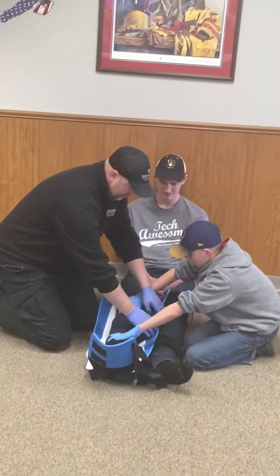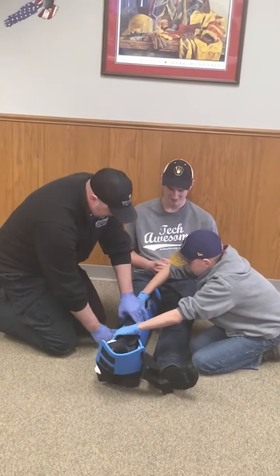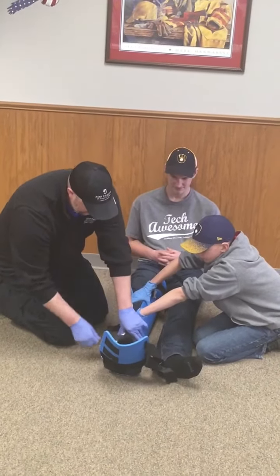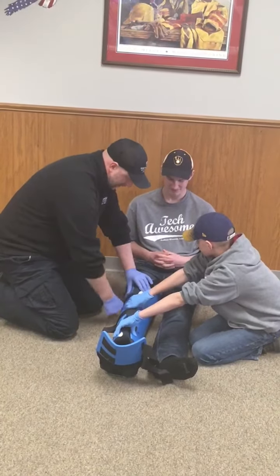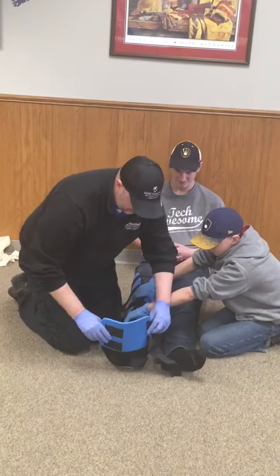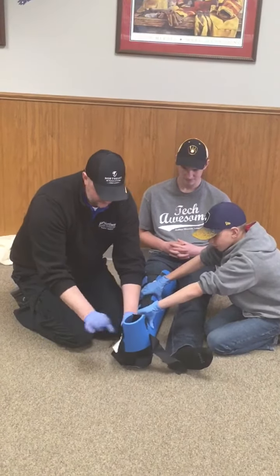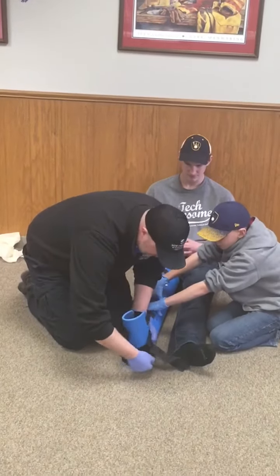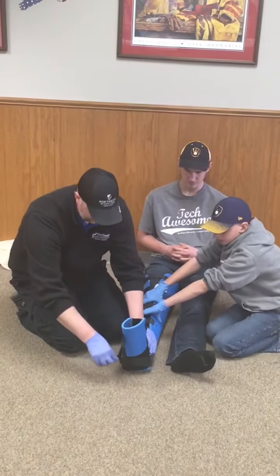Now I can go ahead and start securing the straps. I like to start by stabilizing the bones around the fracture, then work my way down and up the device to immobilize the joints. The knee is now immobilized. I'll bring the foot platform up to 90 degrees, tighten the stabilizing straps to keep that angle at 90, and then secure the last strap around the foot.